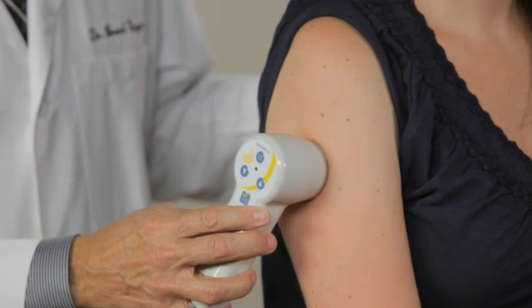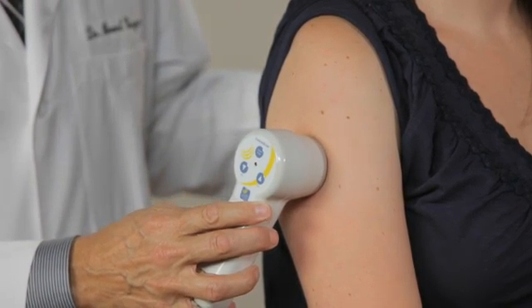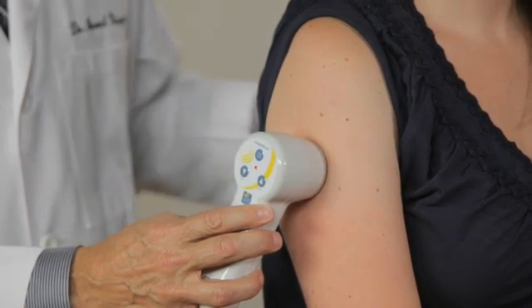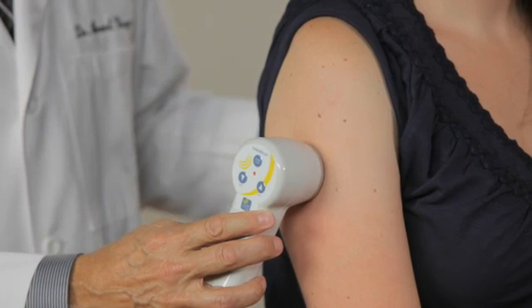As we hear there, there was a drop in impedance. The emitter head picked up that impedance droppage and you can see the light has turned red. That tells us to stop at that particular area.